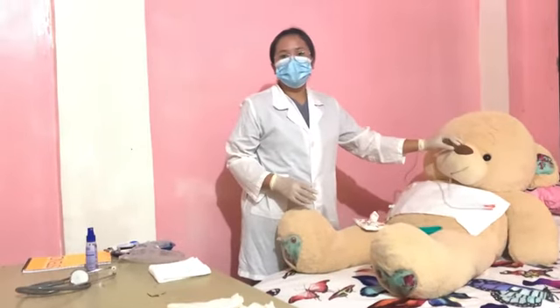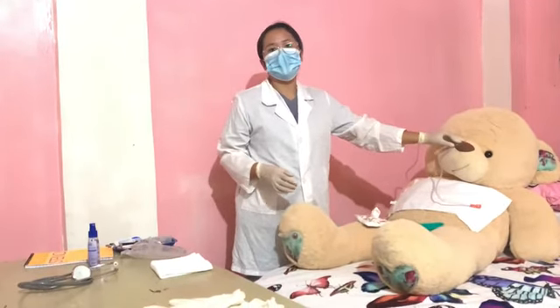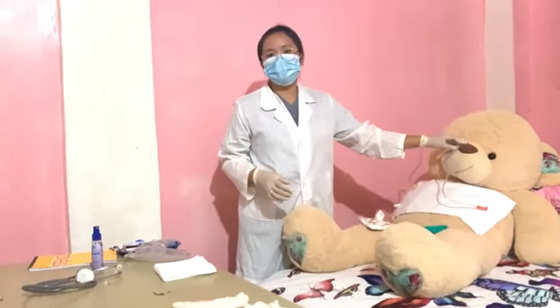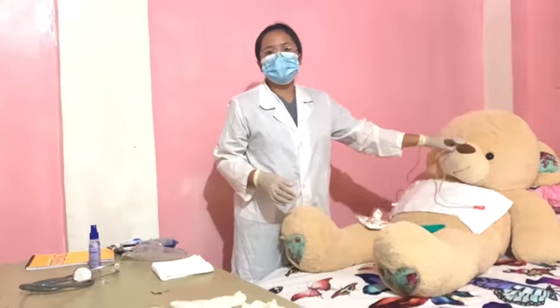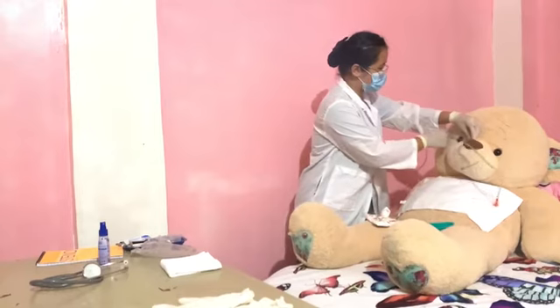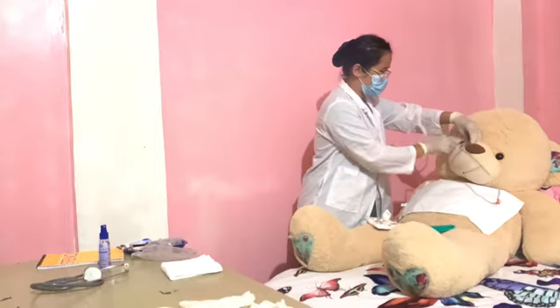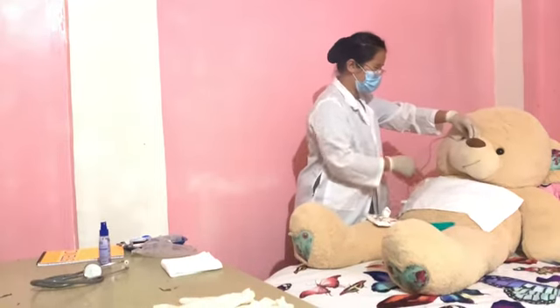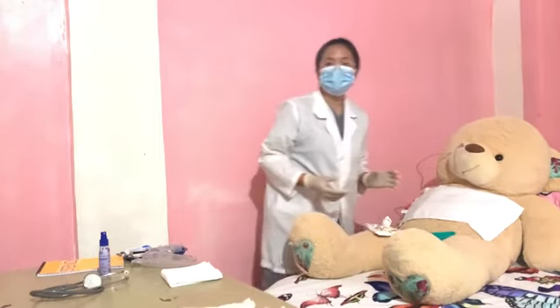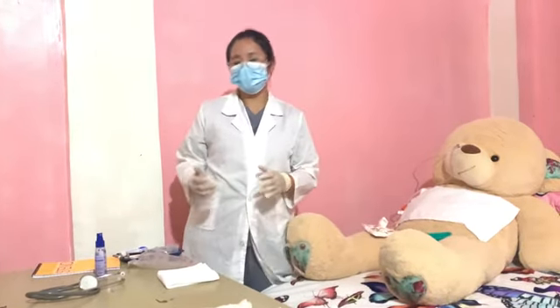Discontinue the procedure and remove the tube if there are signs of distress such as gasping, coughing, cyanosis, and inability to speak or hum. Secure the tube loosely to the nose or cheek until it is determined that the tube is in the patient's stomach. Loosely. And then after that, attach the syringe to the end of the tube and aspirate a small amount of stomach content.